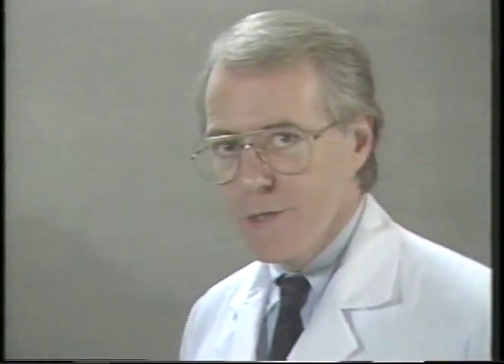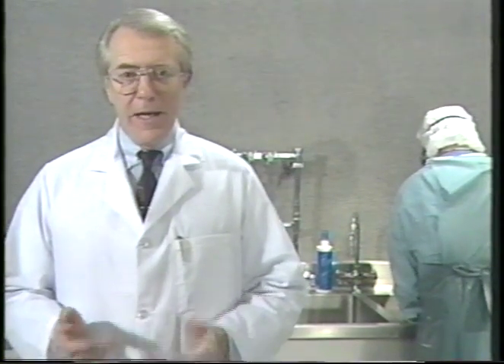This program will focus on the basic principles of washing. Although washing equipment and devices differ at each institution, the basic premises can be utilized in any healthcare or scientific setting. Cleaning seems to be the bane of our existence. It's part of our daily routine and reflects in part our lifestyle.